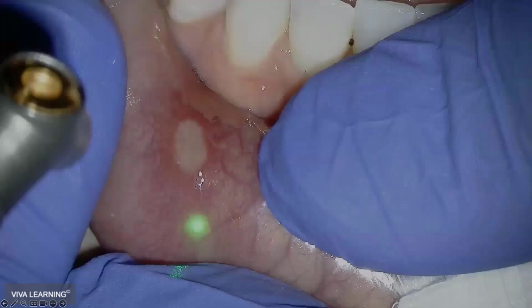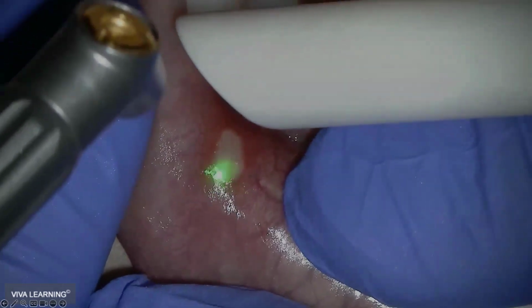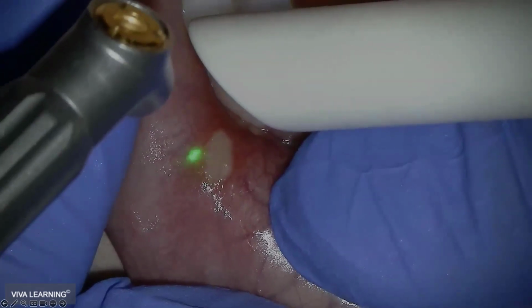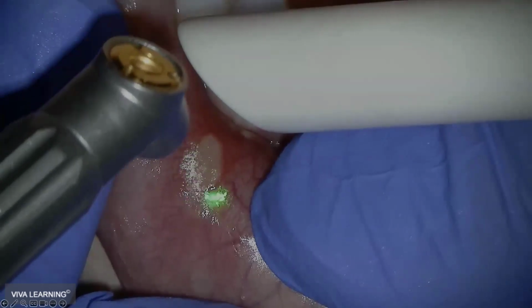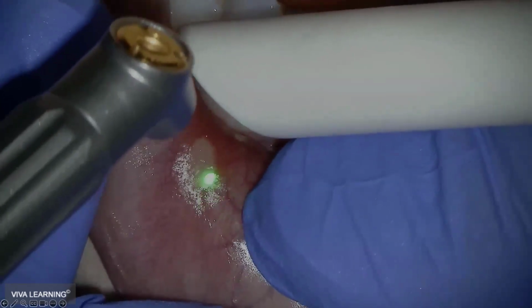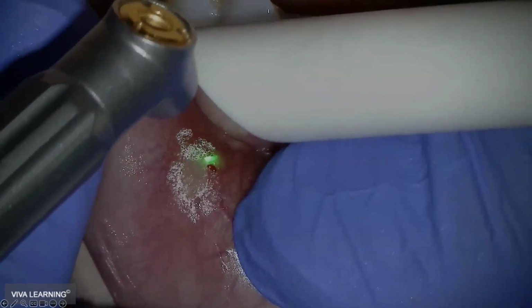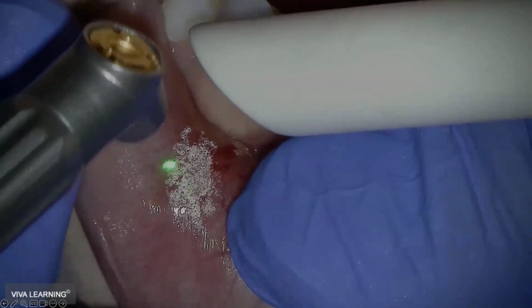So here's basically an aphthous ulcer that we did, where it's hard to tell from the video because it's washed out a little bit, but this was fiery red. It was so fiery red that some of those little areas, as we crossed over them, almost had a little bit of an oozing effect, because we weren't spending too much time on that.